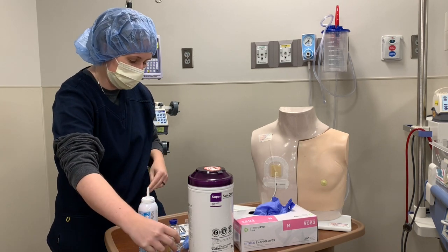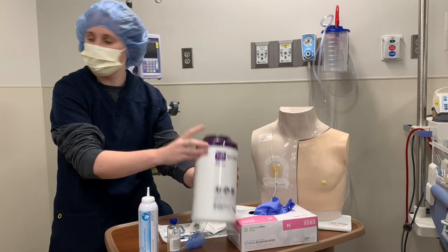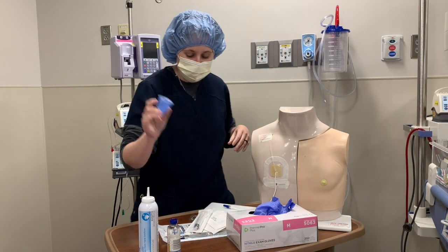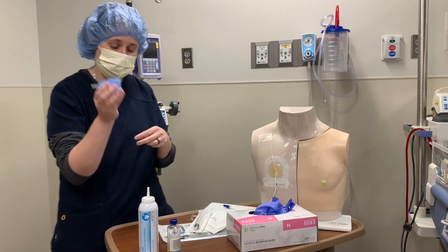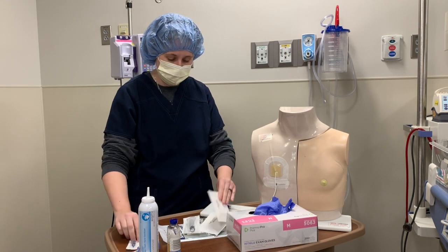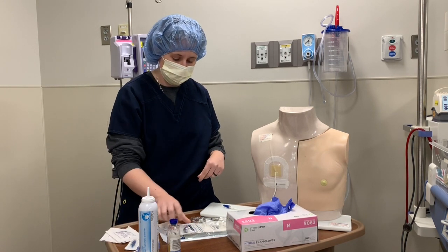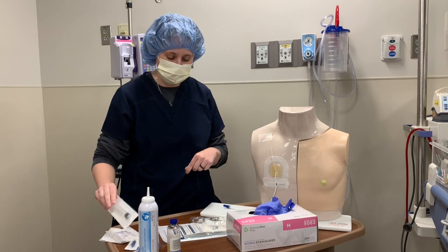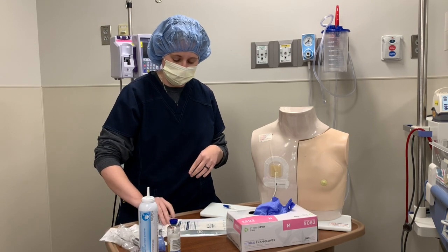Following that, we'll assemble all the supplies. I have a blood culture bottle, some alcohol wipes, and the blood culture transfer device — which would normally come in its packaging. I also have a new needless adapter, some sterile 2x2 gauze, a syringe — it always has to be 10 cc or greater, so this is a 12 cc syringe — some 10 ml flushes, and my sterile gloves.